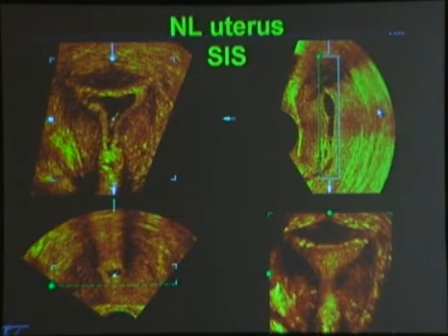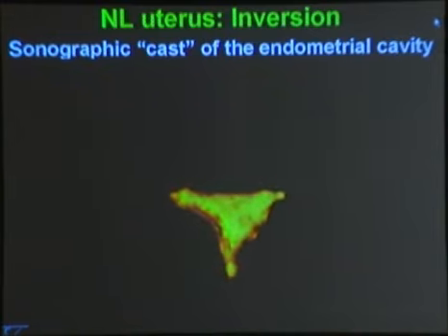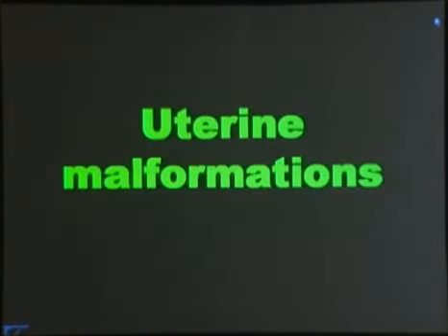Saline infusion of the normal uterus displayed once again in the thick slice, normal fundal contours, normal cavity contours. You can do the inversion displayed in the cast. Our referring physicians love this. They can see that the uterine cavity is impeccable, squeaky clean. Nothing has to happen there.